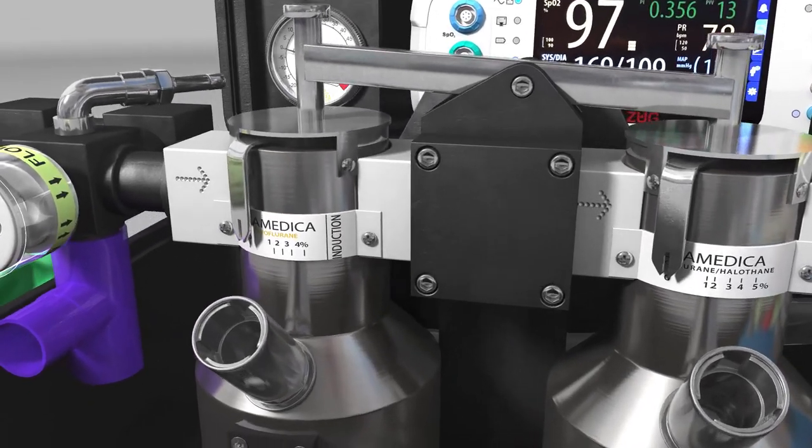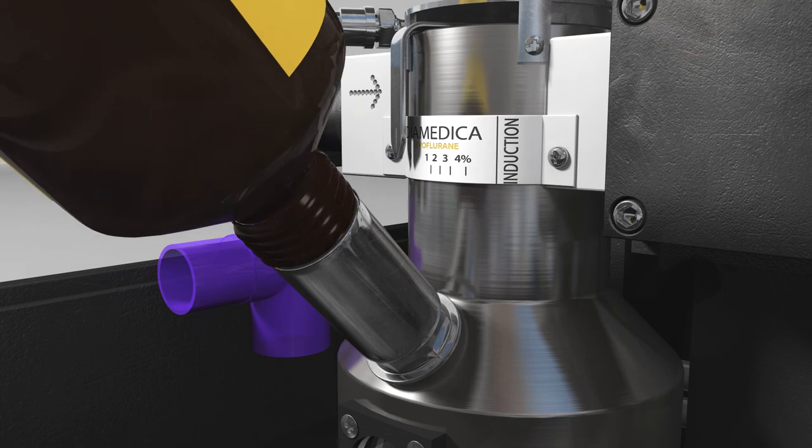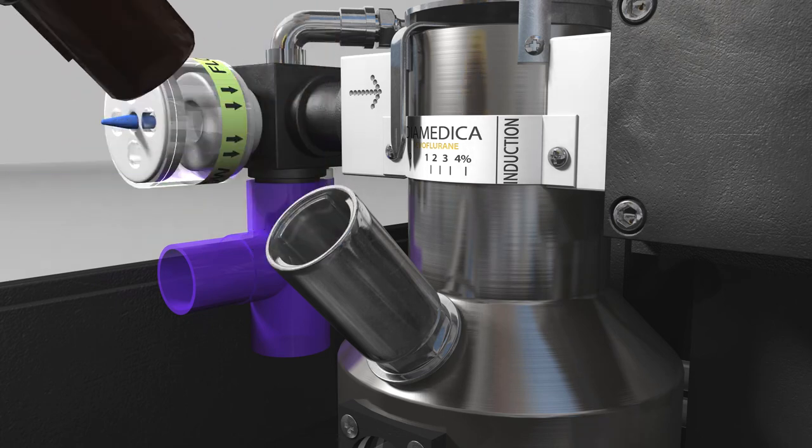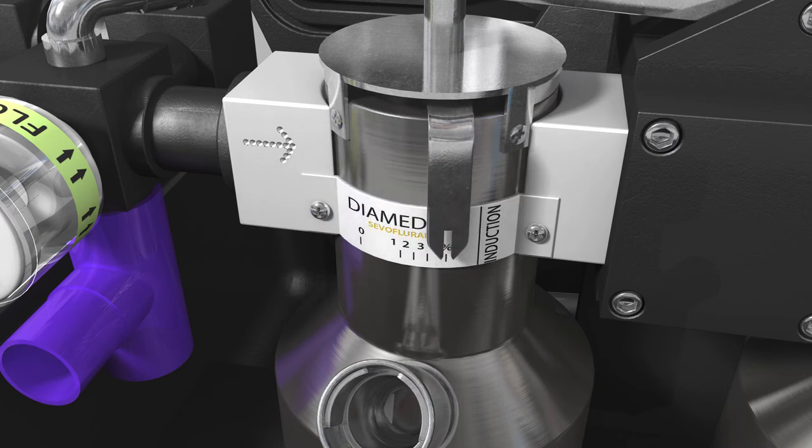The sevoflurane vaporiser is fitted with a key fill and is simply filled by pushing the bottle into the filler cap. The settings on the sevoflurane vaporiser are 1 to 4%, and a further setting for induction that will provide a nominal 8%.